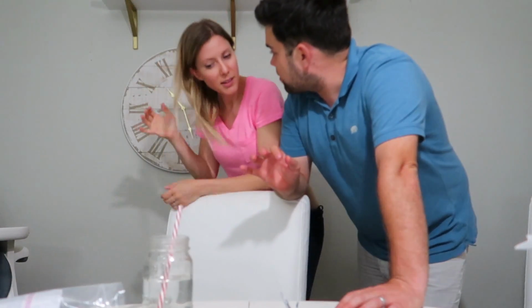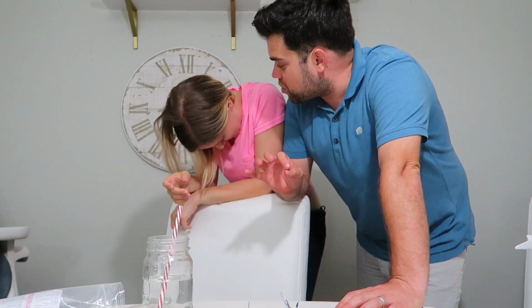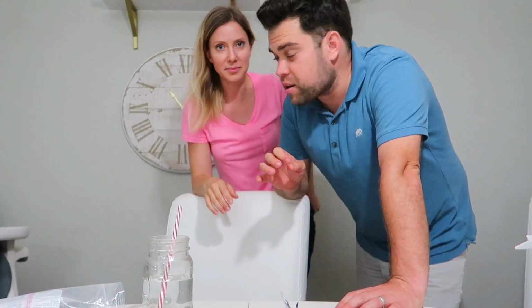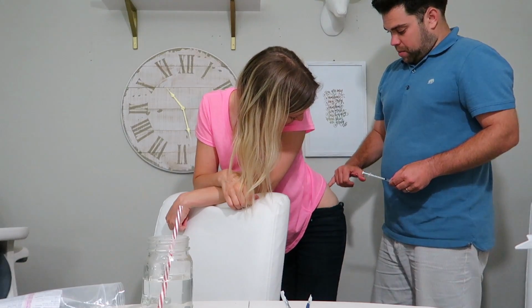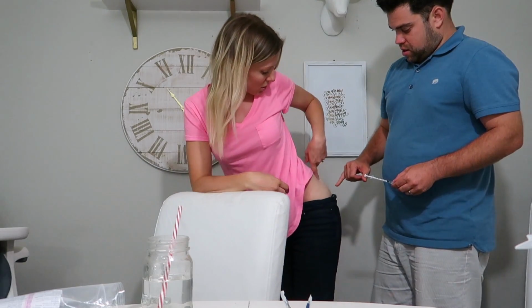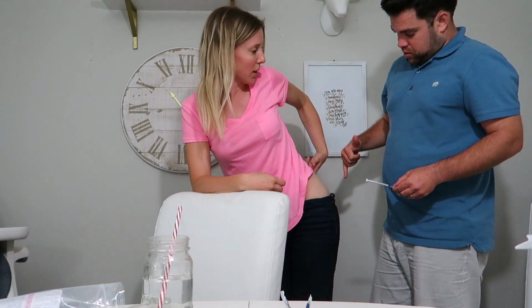Okay. All right. You're sweating. I'm sweating. She's perspiring, everybody. So, question. Your hip is like here. Yeah, that's a bone. Am I going in this way? The circle. I'm going down. You're going straight, into the muscle. Yeah. Like that. Poking it even hurts. Okay.